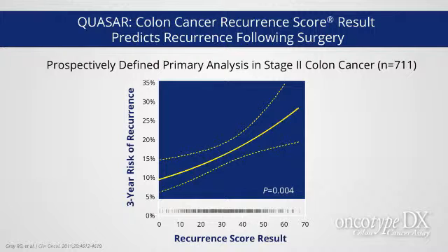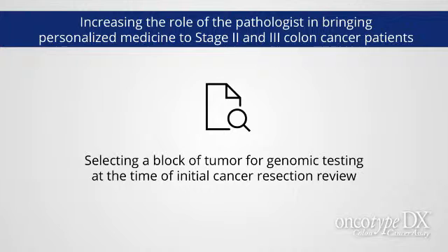And how do you incorporate that into the general workflow when you're dealing with processing colorectal cancer specimens? So at our institution, when we're initially looking at a cancer resection, if it falls into that stage 2 category, we will have the MSI testing done, whether it be MSI testing or the mismatch repair immunohistochemistry, and we'll have that result.